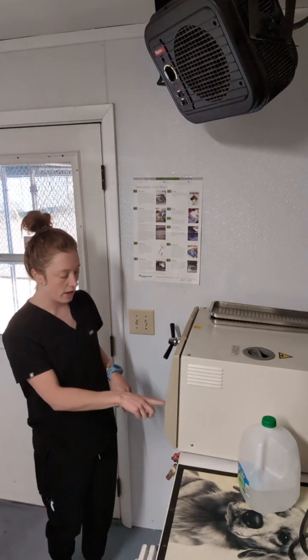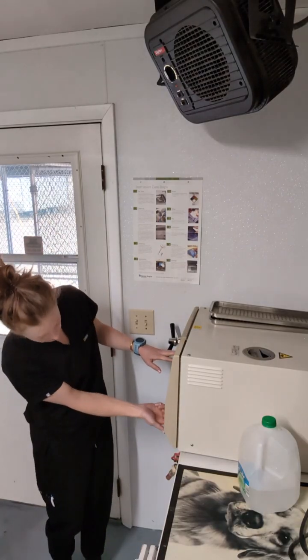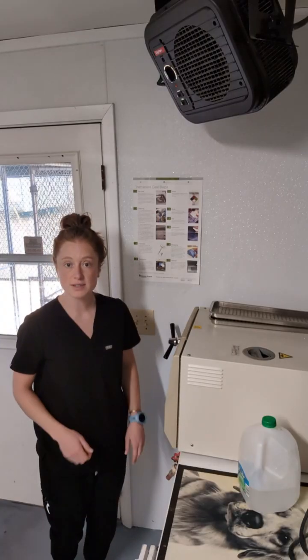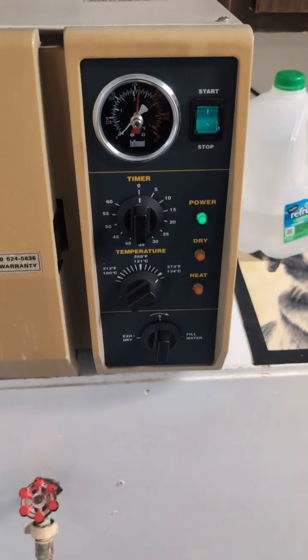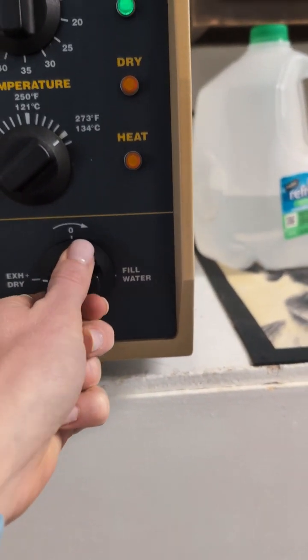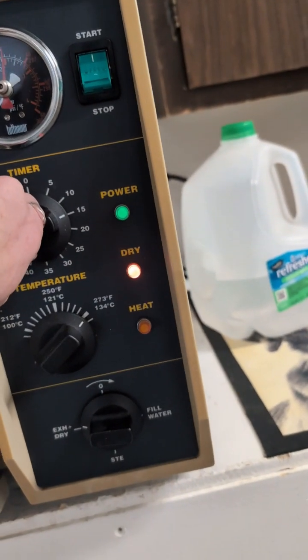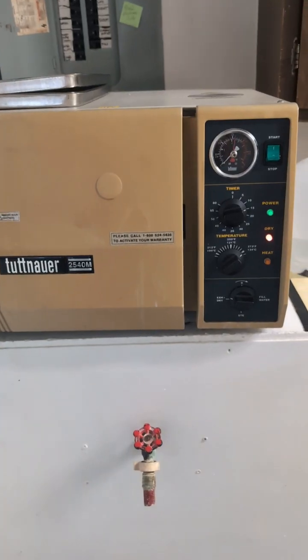I'll turn it on. I have the temperature at 273. Switch it to the steam setting, and I'm going to turn that on for about 30 minutes. So the timer on the autoclave is at 0 and it's no longer on. So I want to switch the setting now to exhaust and set the timer again for about 15 minutes. That'll help release all of the pressure that's in there.